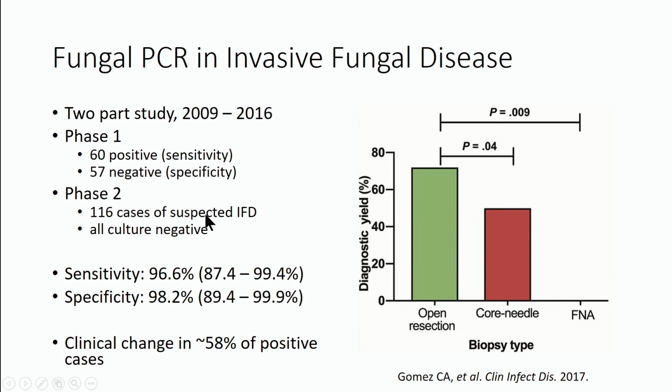They followed that up with 116 culture-negative patients, all of whom had suspected invasive fungal disease. So you can see high sensitivity and specificity. The true specificity is probably higher because one of their negative cases was actually, they believe, a true positive, based on the PCR result clinically.